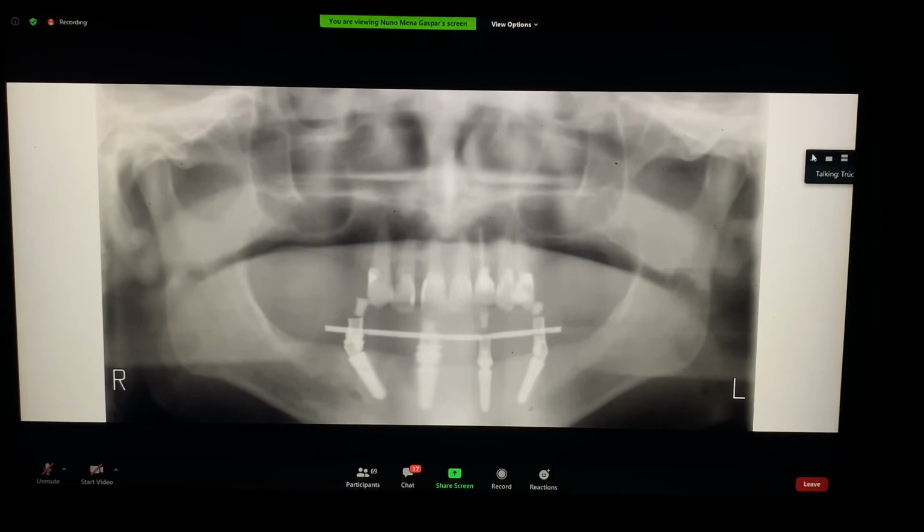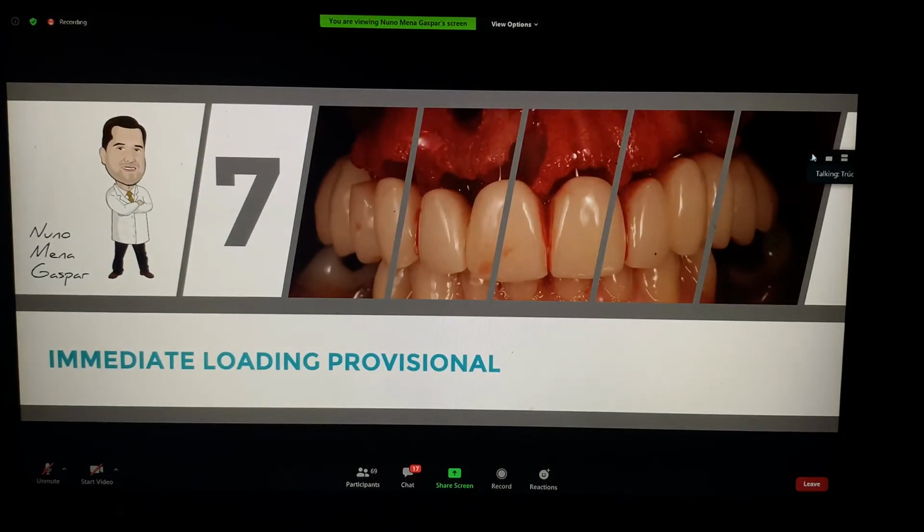If we do not have a surgical guide, so we start placing the implant freehand, how can we identify where we place the implant? You don't have this metal guide I showed you? Yes. The question here is, when we place a tilted implant, how can we avoid the sinus?